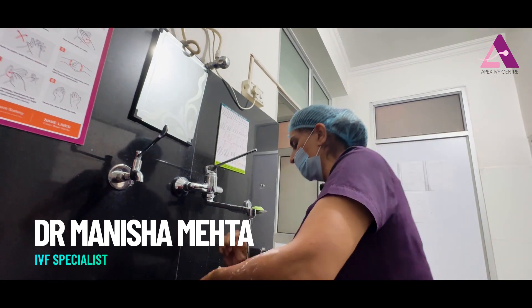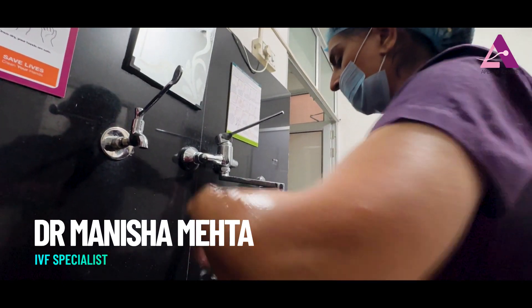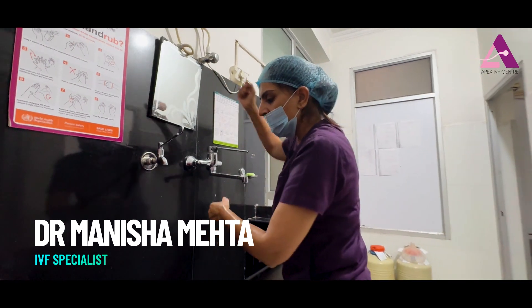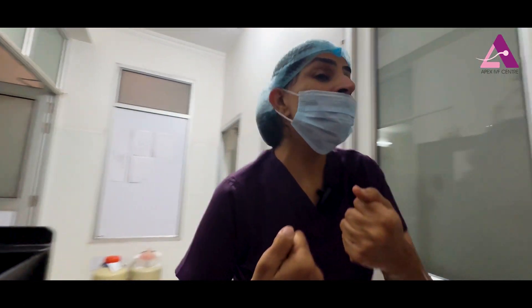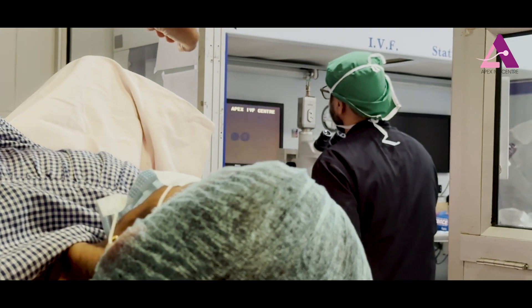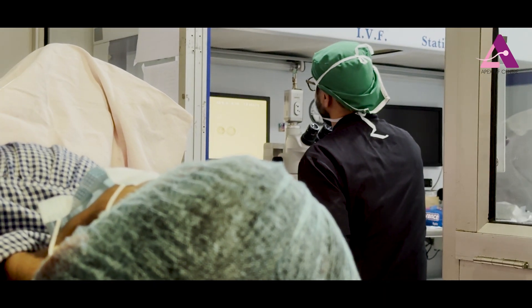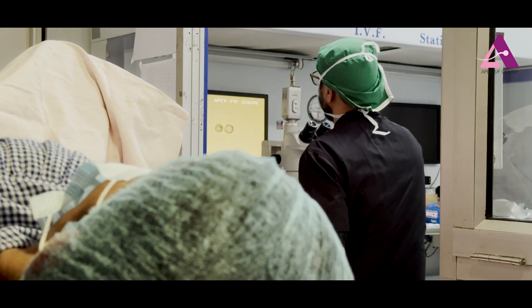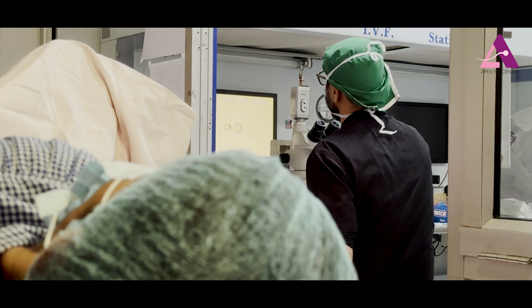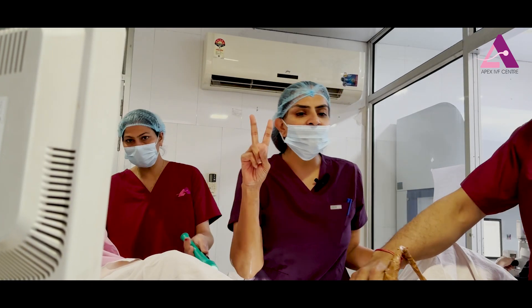I usually don't like to use any makeup or cosmetics inside the lab, and I also don't use gloves. The patient is shown her blastocyst — she checks her name and then she sees them.